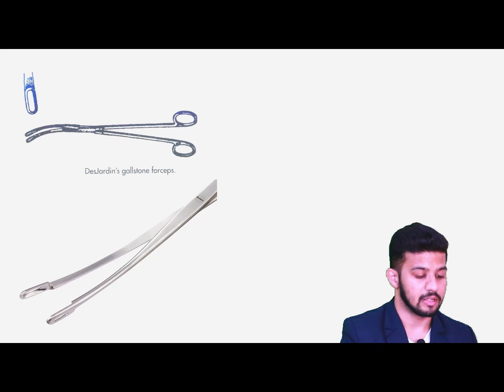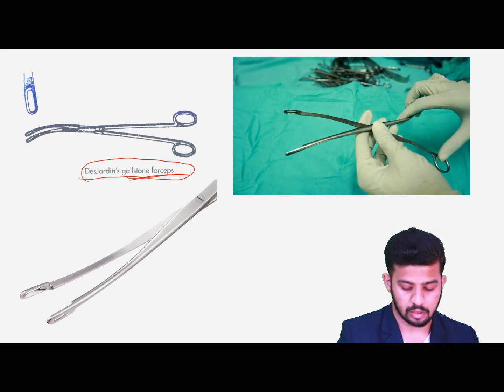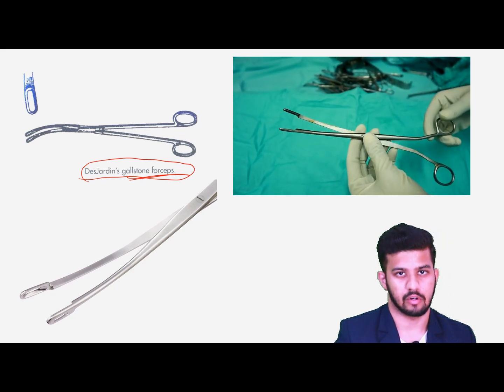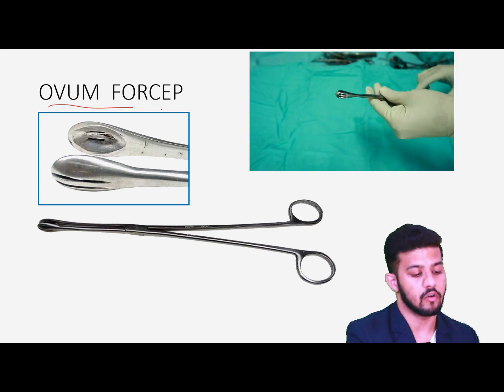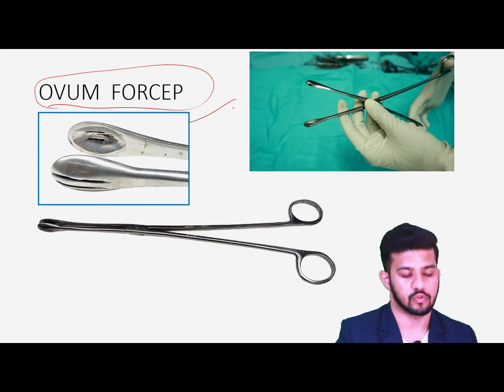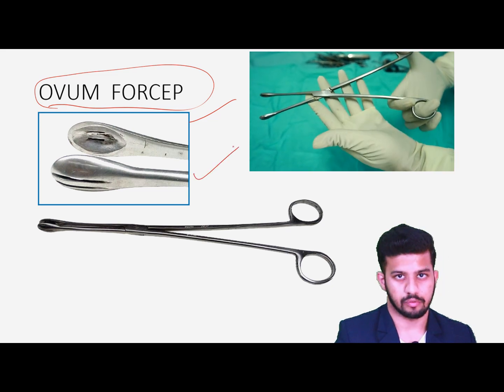Then we have the gallstone forceps for removing stones from inside during open common bile duct exploration or from the gallbladder. Then we have the ovum forceps for removing products of conception from inside the uterus, or sometimes also used for removing stones from the gallbladder.